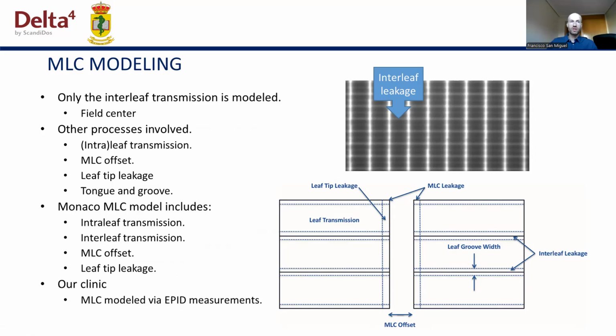For all these reasons, differences between the treatment planning system and Insight are expected in highly modulated plans. The greater the modulation, the larger the expected difference.